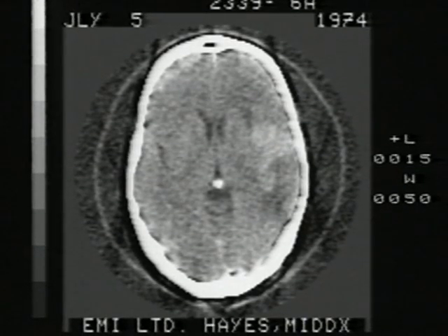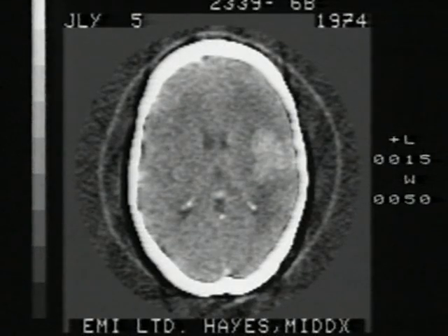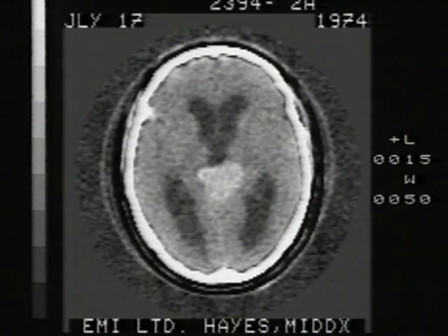The most dense tissue, that is bone, is depicted as peak white, while the least dense tissues, air and cerebrospinal fluid, are depicted as black. Soft tissues of the brain are depicted in shades of grey, shading from dark to white with increasing density. By operating the appropriate controls, the operator can select a display which gives maximum detail for the tissues under examination.